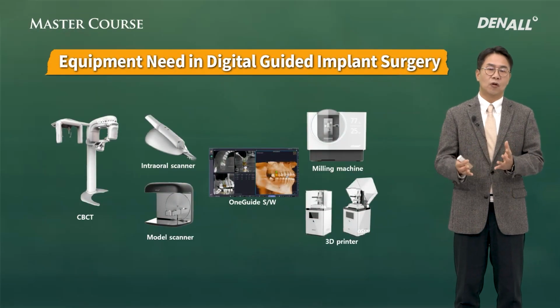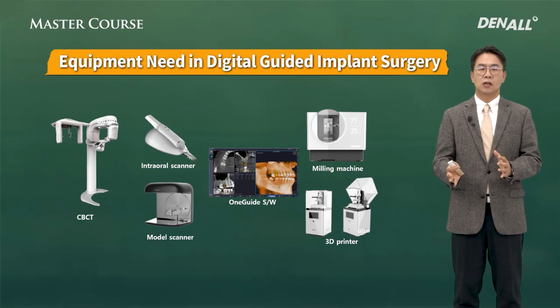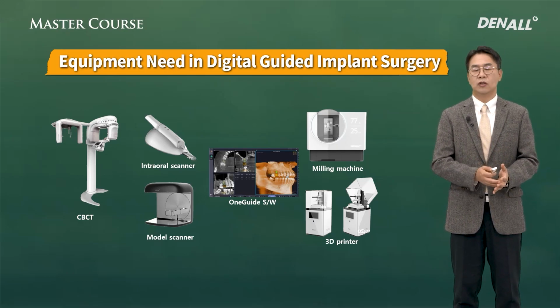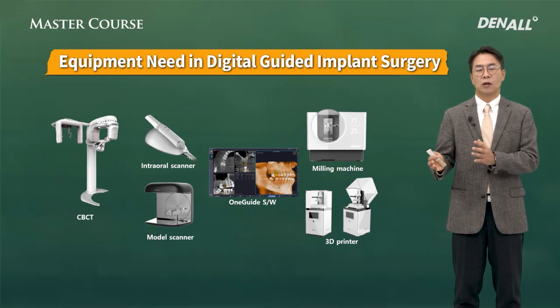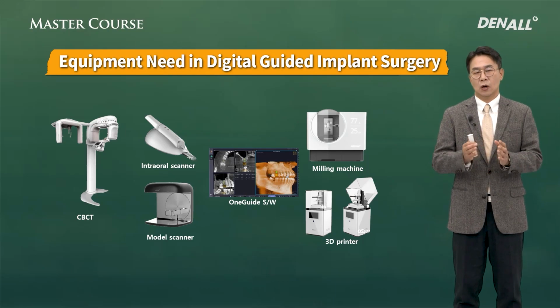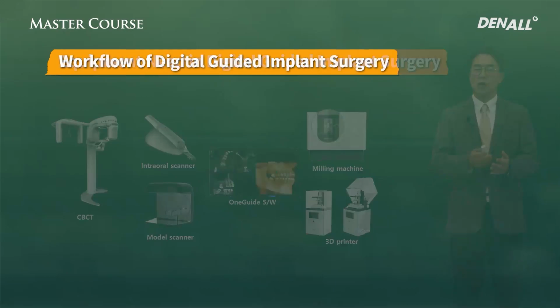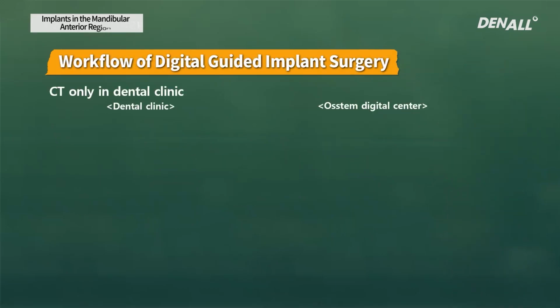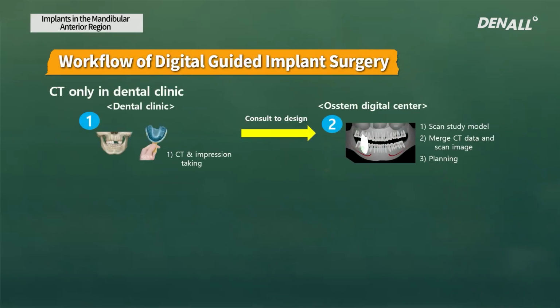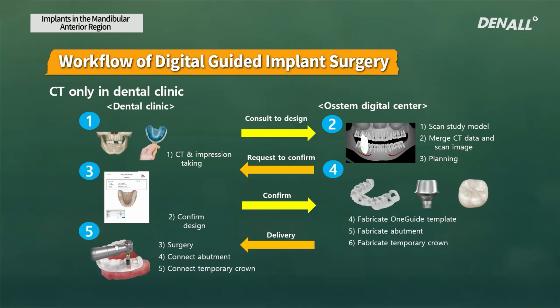There are many different devices available. Today, many clinics have CT machines, so there's no problem with that. It's not easy to have all the machines or equipment beginning with the scanners and software and CAD machine. So this is a step-by-step process, and it takes time, and you cannot do it all at once. At each step, you need to take time.